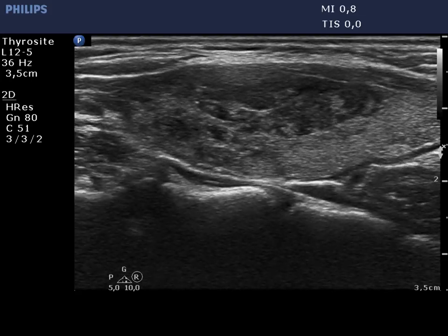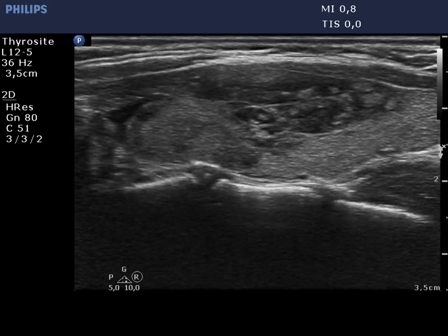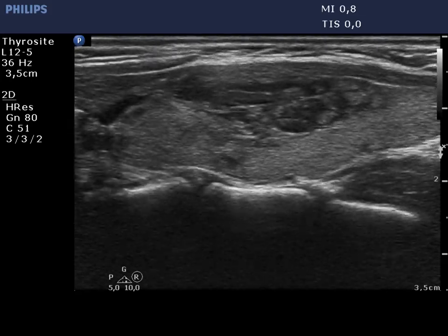There is a large hypoechoic field in the left lobe. Note the presence of intralesional ragged isoechoic tissue and fibrosis. The lesion has a puzzle-like border.